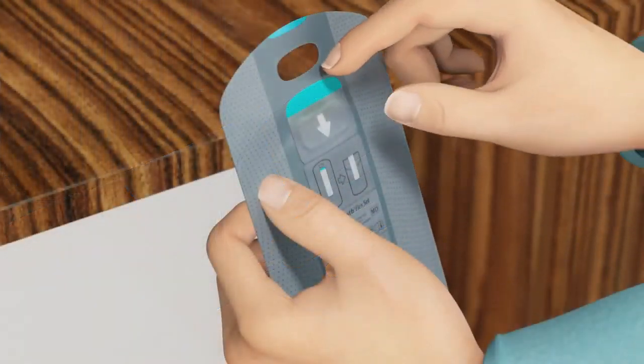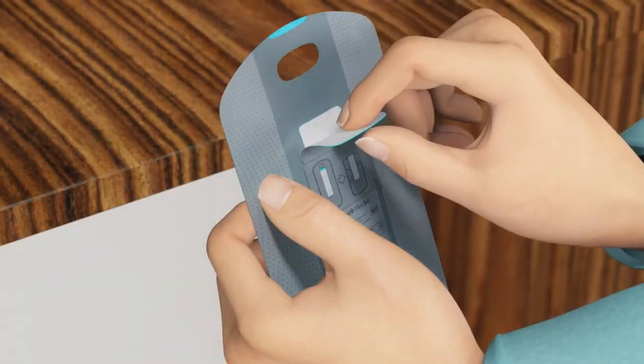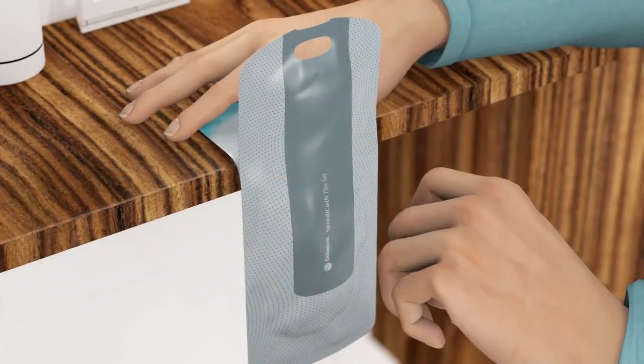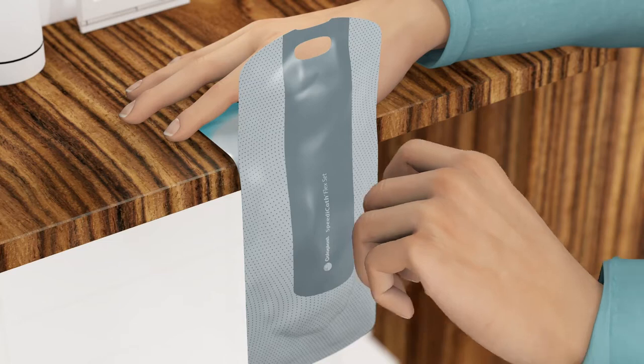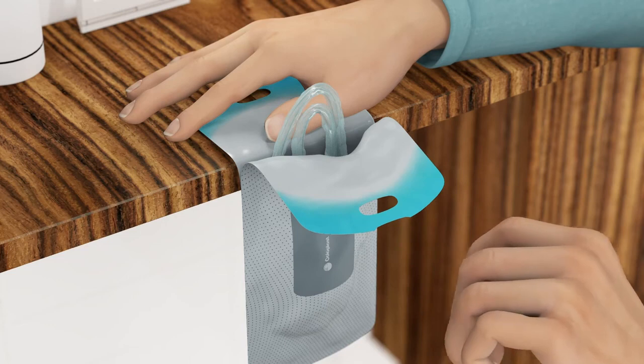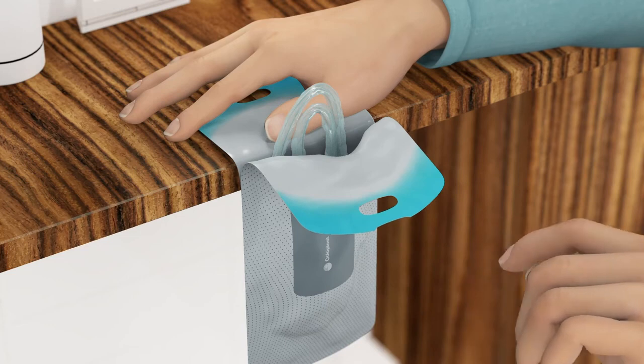First, remove the cover label from the adhesive label. Then attach the adhesive label to a clean horizontal surface. The packaging must hang so that you can easily reach it when you're ready to use it. Open the upper end of the packaging by pulling the ring towards yourself and then downwards. You can also open the packaging without using the ring.